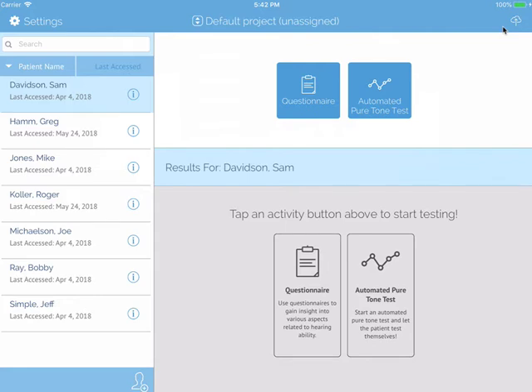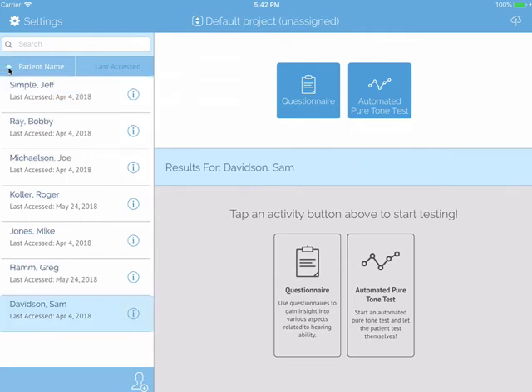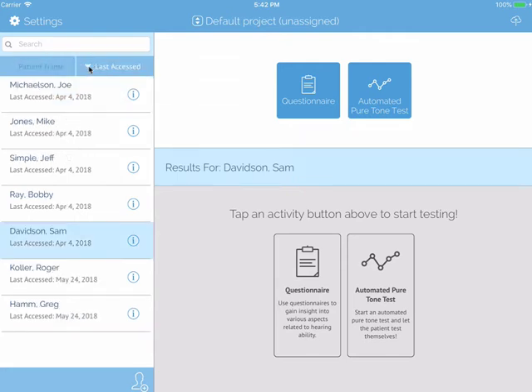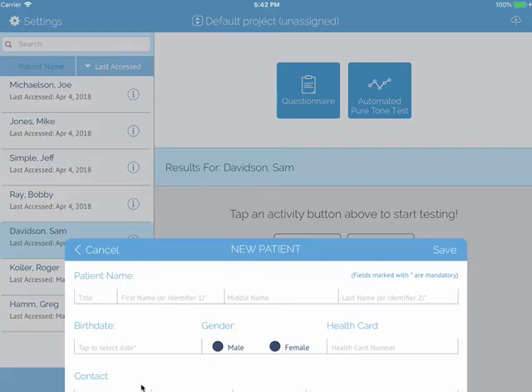Your patients will be listed on the left-hand side. You can search for patients, sort by name in ascending or descending order, or by the last patient that you accessed. To add a new patient, near the bottom left corner, you will see the silhouette of a head with a plus symbol beside it.